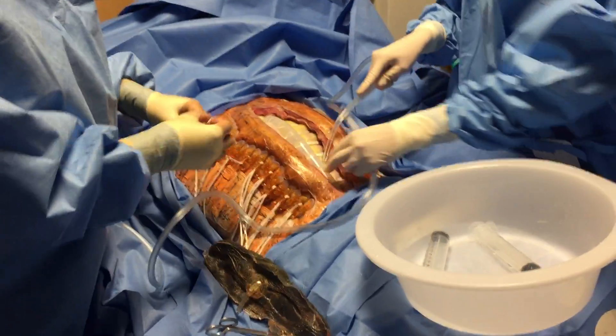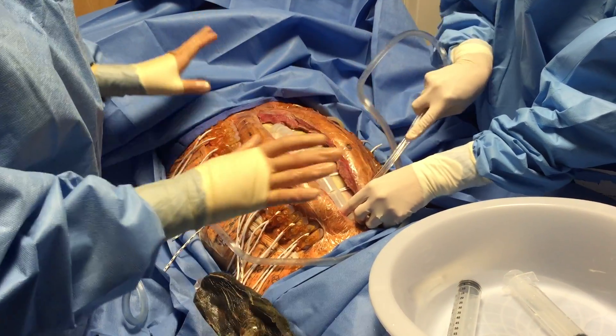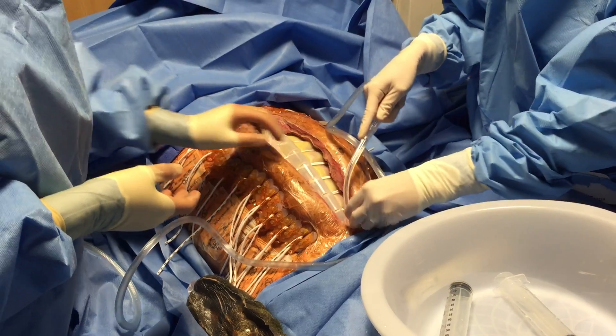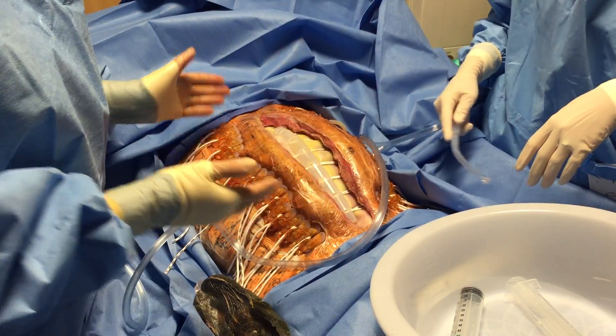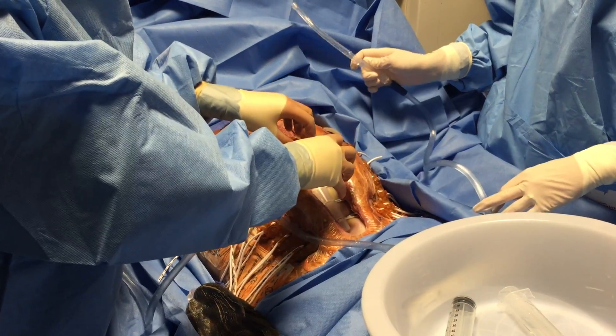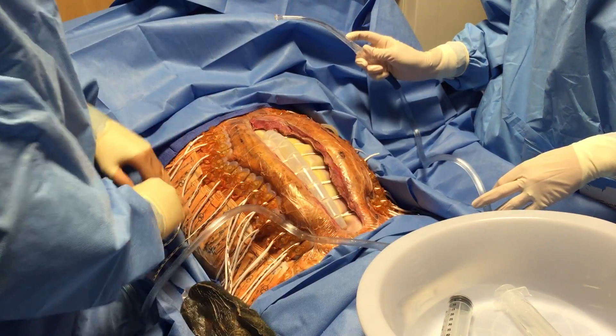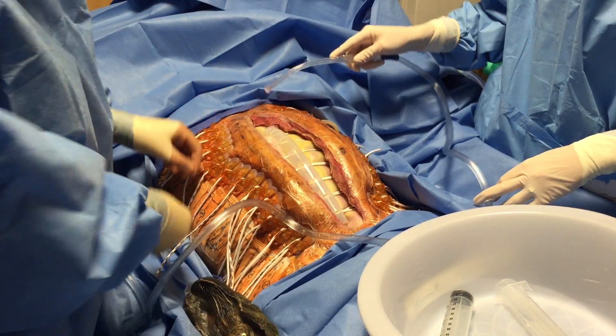When I prepped over this, I use a ChloraPrep. There is no exposed tissue, so a ChloraPrep over the top is really all that you need, because this remains sterile on the inside and has not been contaminated. So over the top — including the elastomers and the tails — a ChloraPrep. That's really all that you need.